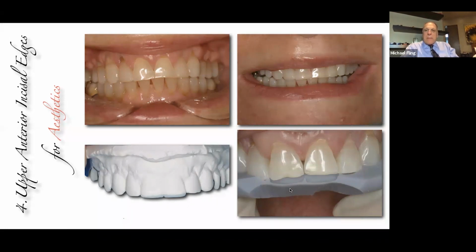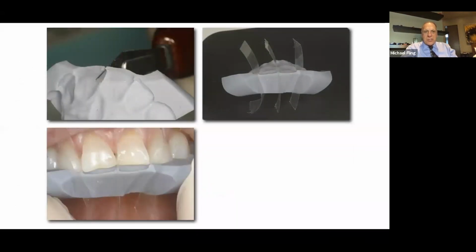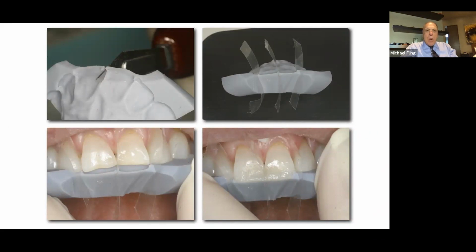The stent would be placed on the lingual of a working model, and that's what we would stack our porcelain into to build up the crown. So I just thought to myself, why in the world don't we do that when we're doing restorations? So here you see, I've done my wax up, I've made a Seal-Tech stent, I cut it back.